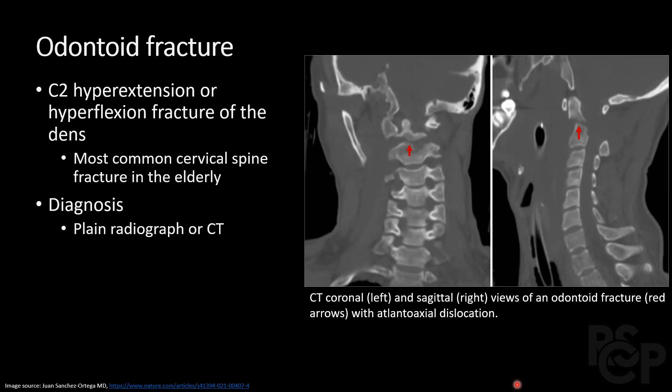Moving on to C2, we can have a fracture of the odontoid process, also known as the dens. It is commonly due to hyperextension or hyperflexion, and it is the most common cervical spine fracture in the elderly population. It is relatively easy to see if there is a large amount of displacement, as shown here.